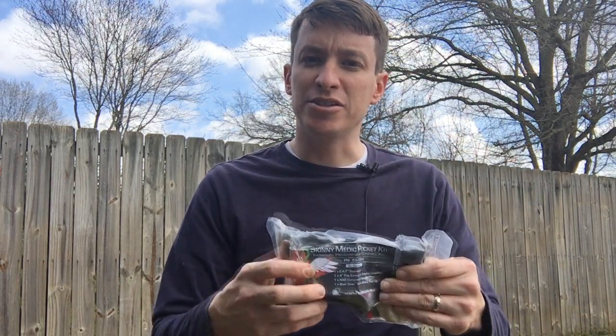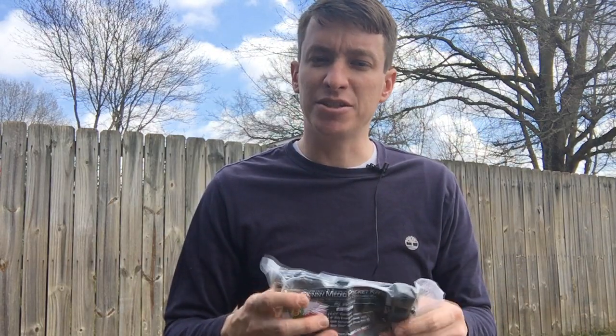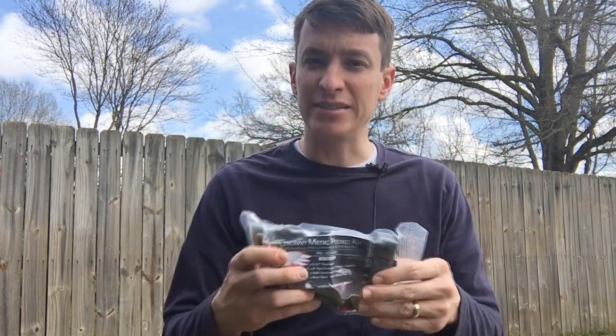Hey, welcome to another video from Skinny Medic. I have the Skinny Medic Pocket Kit here. This is a partnership I did with North American Rescue to come out with a really cool kit that you can carry on a daily basis as part of your EDC to have a trauma kit, because you never know when you'll be the first responder.